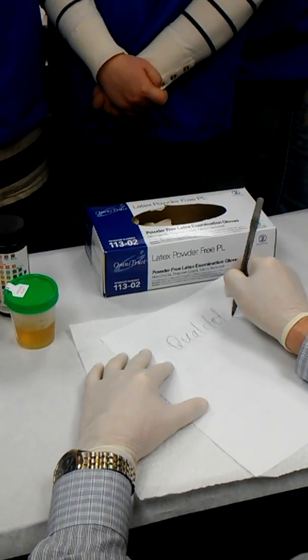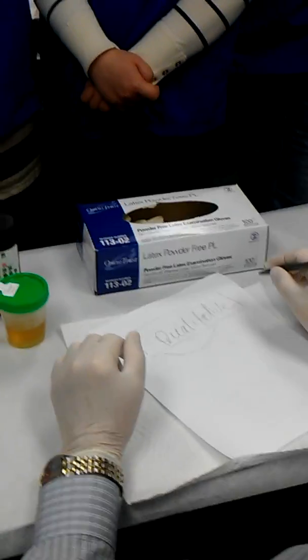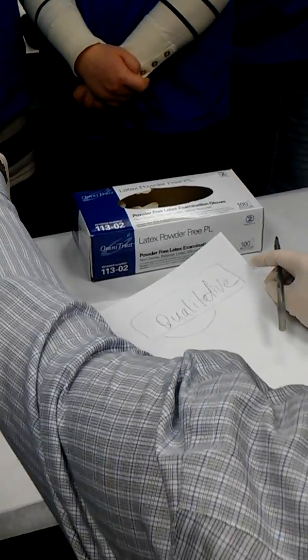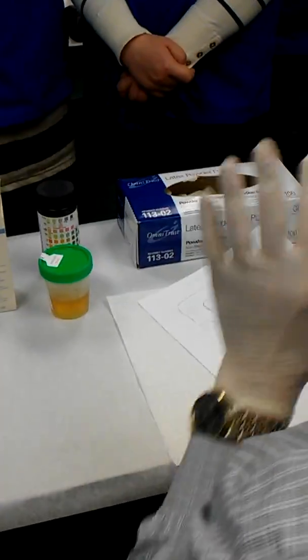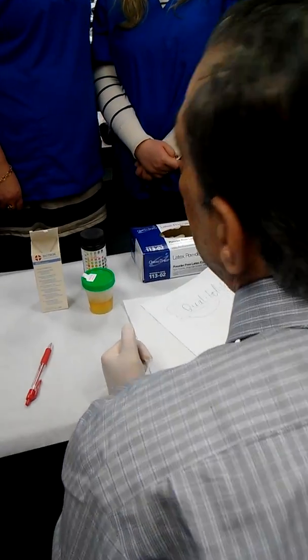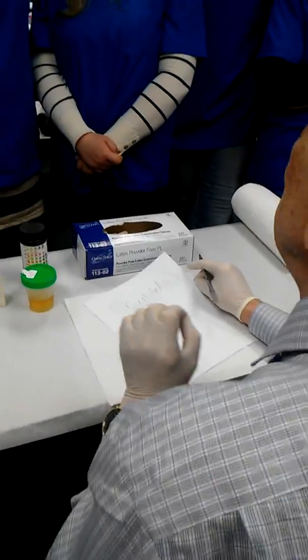Qualitative, right? So what is qualitative? From the word quality, качество, right? It means that you detect some substances, 10 substances in the urine, only detect them. So it's a quality test, qualitative test. We're not calculating the amount of this substance in the urine.